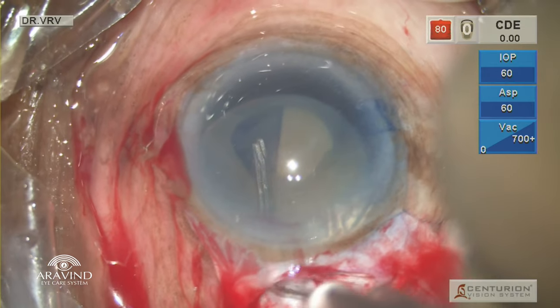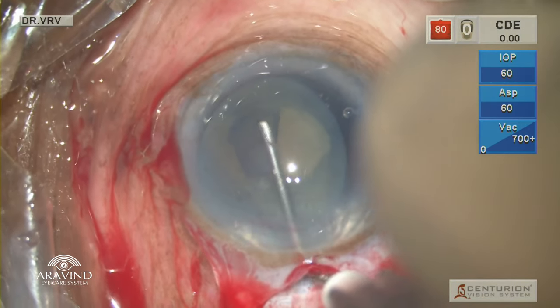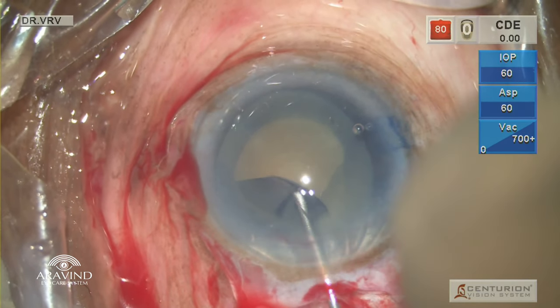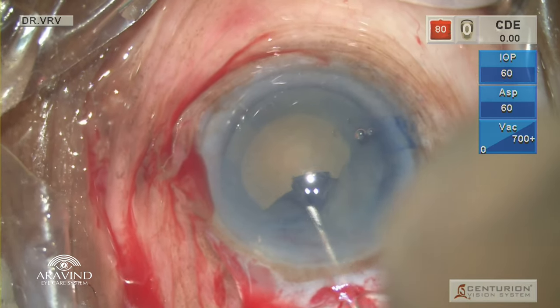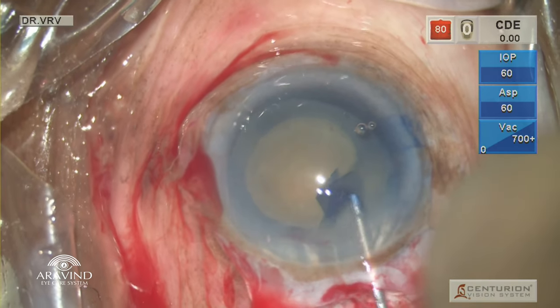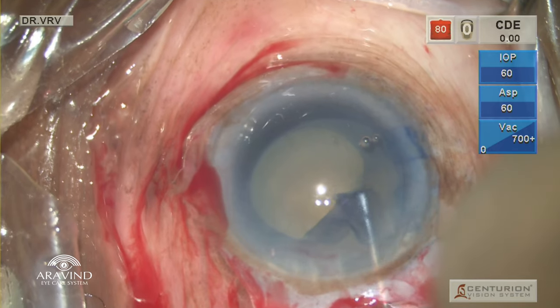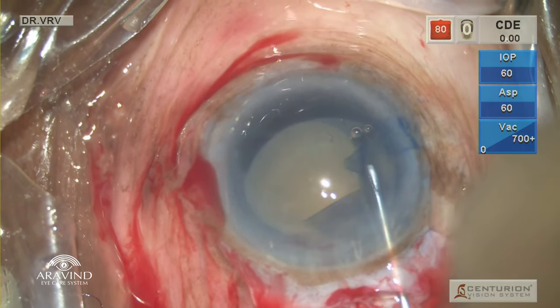As there is no underlying nucleus, it is difficult to do the rhexis. So in that case, push the nucleus towards the area where you are doing the rhexis. So when I'm doing superiorly, the nucleus is dragged to the superior side. So when I'm going temporally, it is dragged to the superotemporal side. By doing this, it will mimic a regular rhexis, because you need some hard surface underneath the capsule for you to have a proper rhexis.